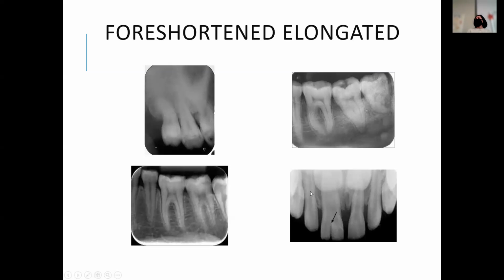But does this look like it's foreshortened or elongated? Yeah, they just look stretched, right? So I feel like it's just something where you see it and they start to have this stretched appearance, or they have a smushed appearance. And then the ones that are a little distorted, as long as it's diagnostic in real life, nobody's going to get really that worked up about it. And it's a little harder to identify. So I tend not to be too hard on that. But that is stuff you should look for.